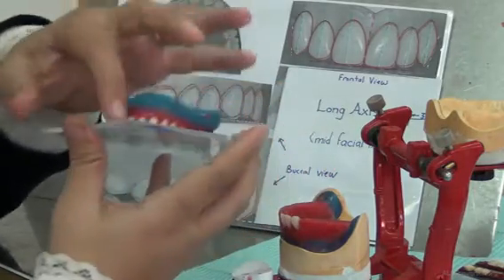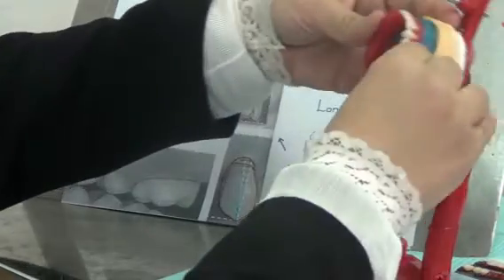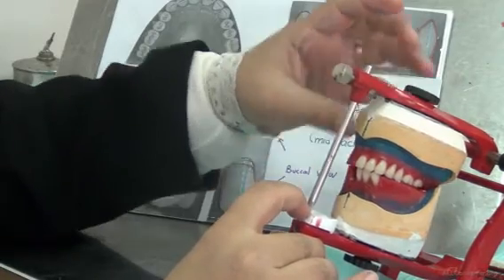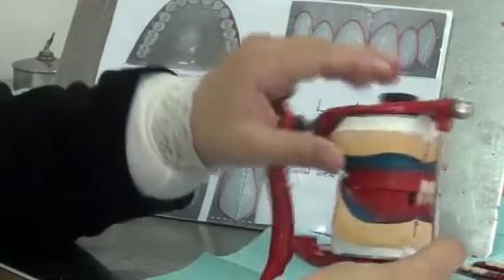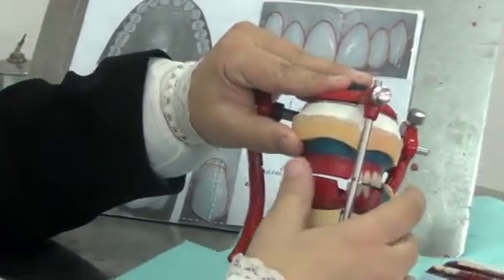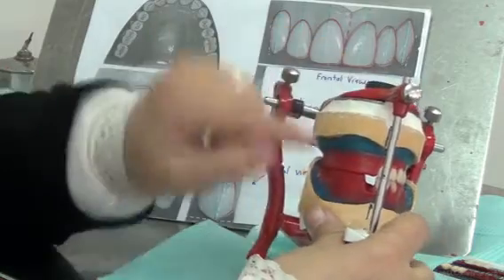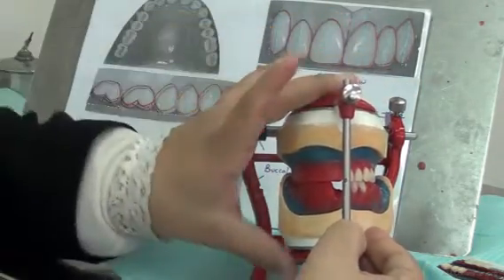So whenever I add a tooth here, make sure you go back and put the base plate on the articulator, close it, make sure that the pen is still on the table, touching the table, and the wax rims are still in contact. If we don't have the wax rims in contact, what might have happened is that we have set one of the teeth in the upper jaw high. So whenever we're setting, we need to go back and check that the other side of the wax is in total contact and the pen is touching the table. So this is the first check we do.